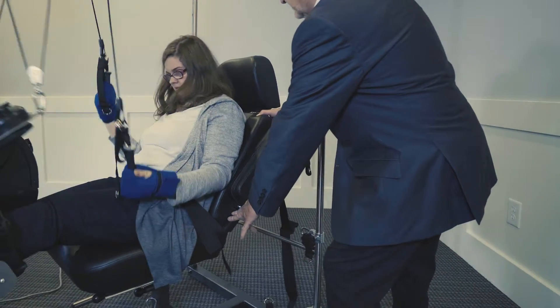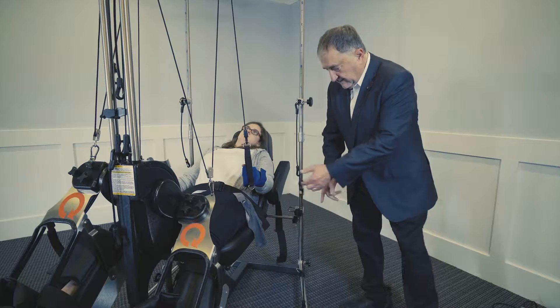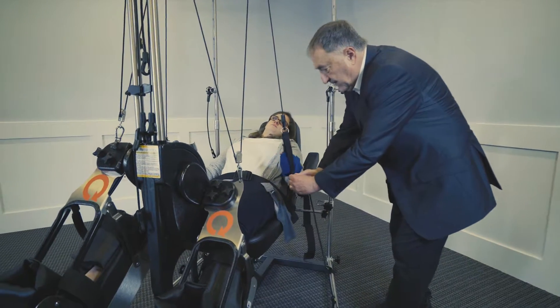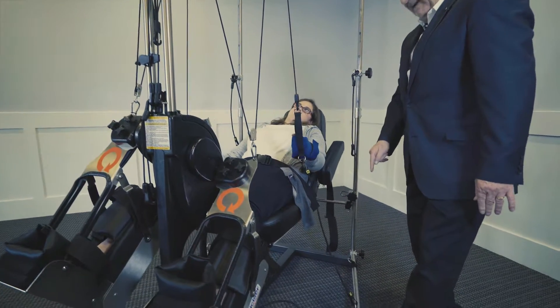You can just go ahead and fall asleep, lean back and relax. She has a little bit of trouble coordinating the hand going down, so we have tension cords we put right here. When the motor turns, the hand has to come up this way, and this is going to pull it back down.